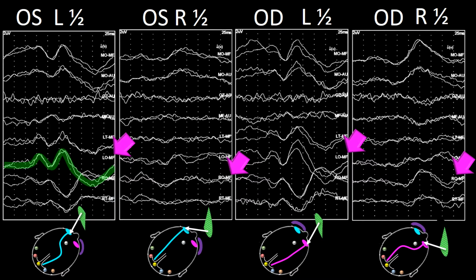The horizontal line to which I alluded at the beginning of this question consists of the wave of each of these derivations. I have represented one of them in the first panel by highlighting them with green color. Now I have placed the vertical line. The vertical line corresponds to time, that is to 100 milliseconds after the stimulus.